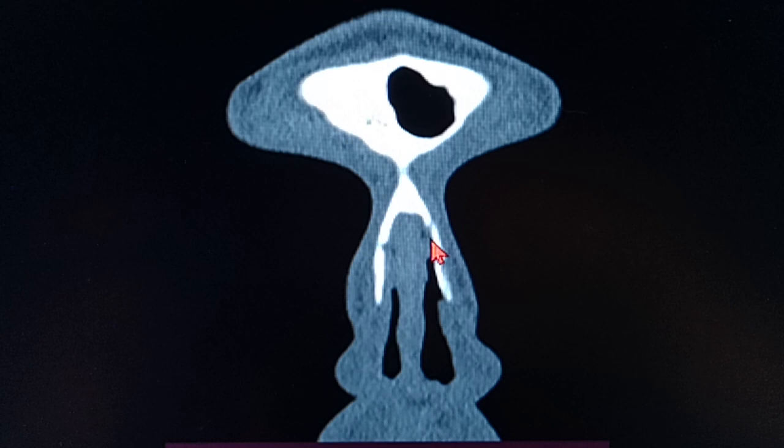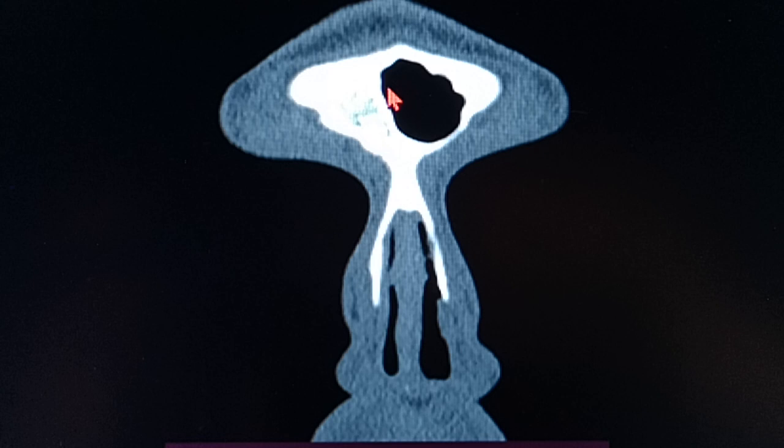Still, the cartilage you can see over here, that's the nasal septum. You can actually see the left frontal sinus, which we will be confirming later on again. So as we keep on going behind, you can still see that this is becoming larger. Still, there is no evidence of any right-sided frontal sinus, and now you can actually start seeing the actual frontal process of the maxilla over here. So this elongated process is actually the frontal process of the maxilla.